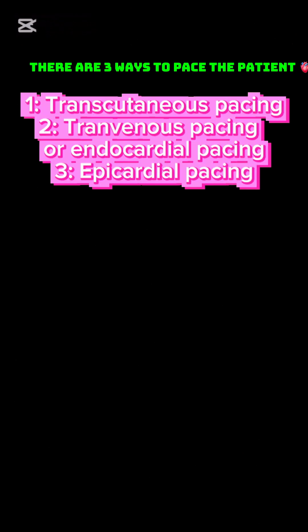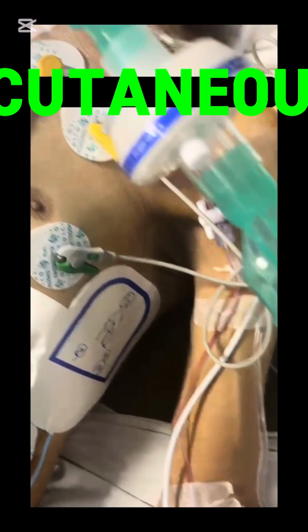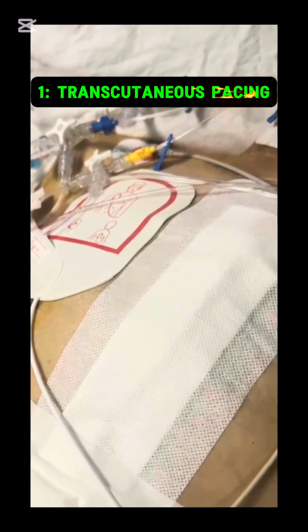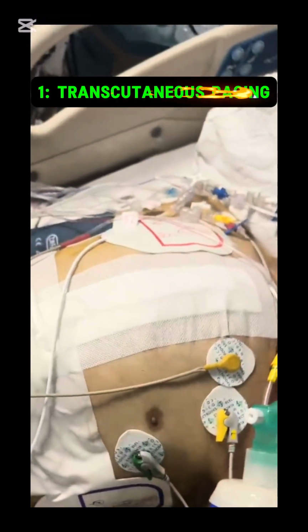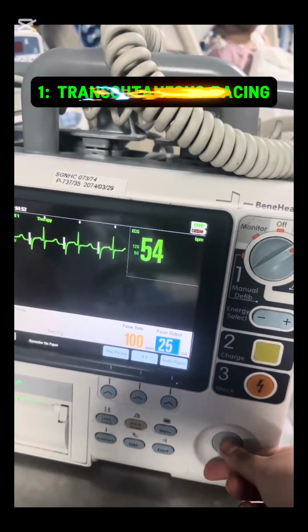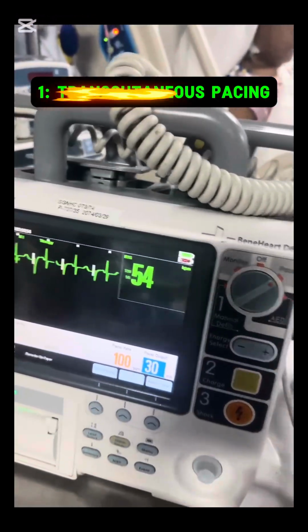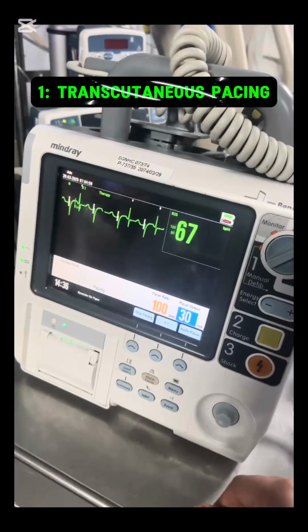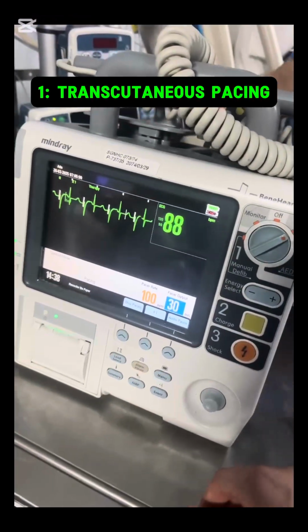There are three ways to pace the patient. One is transcutaneous pacing, second is transvenous or endocardial pacing, third is epicardial pacing. In transcutaneous pacing, electrical shocks are given through pads attached to the patient's chest, and it is most commonly used in emergency situations that require pacing promptly.